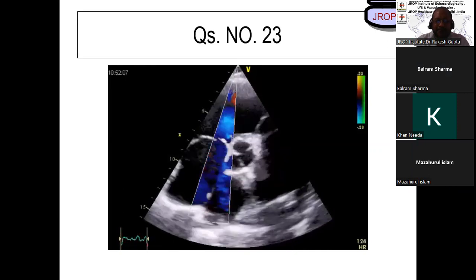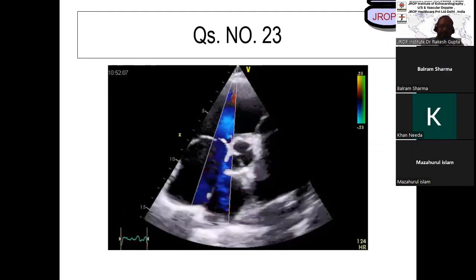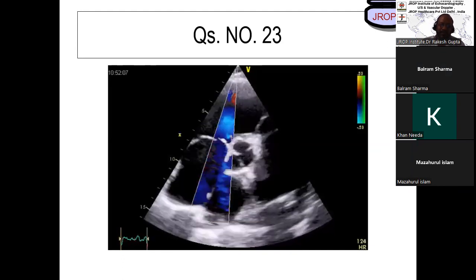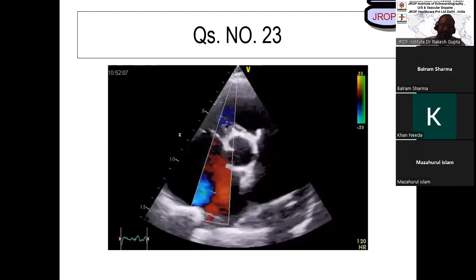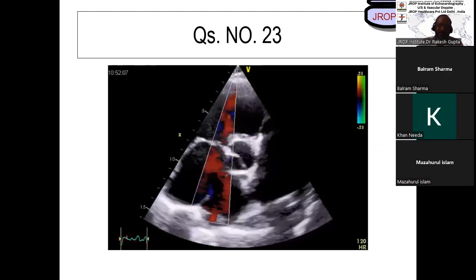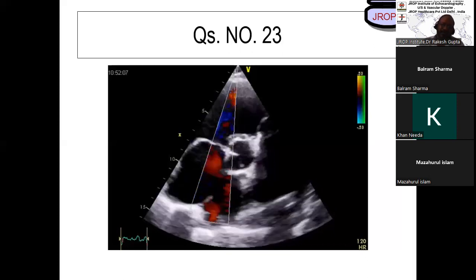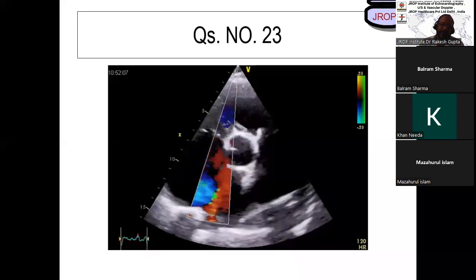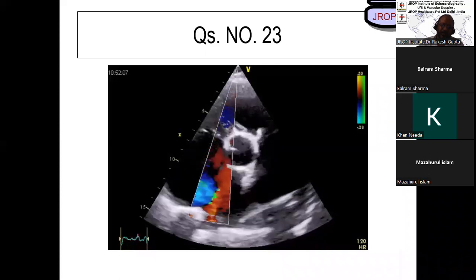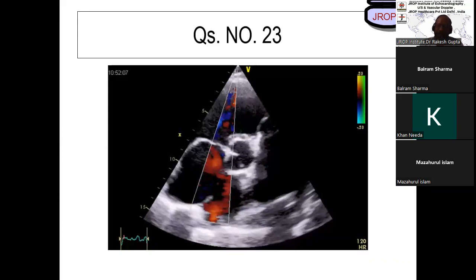So looks like a short axis view at the aorta. Okay. It seems like there might be some flow between the LA and the RA. Right. Good. RA seems a little dilated. Right. I don't know. It's hard to tell. I'm not sure if the flow between the RA and RV is appropriate or not. It seems like maybe the valve isn't opening correctly. The valve is opening. It's fine.